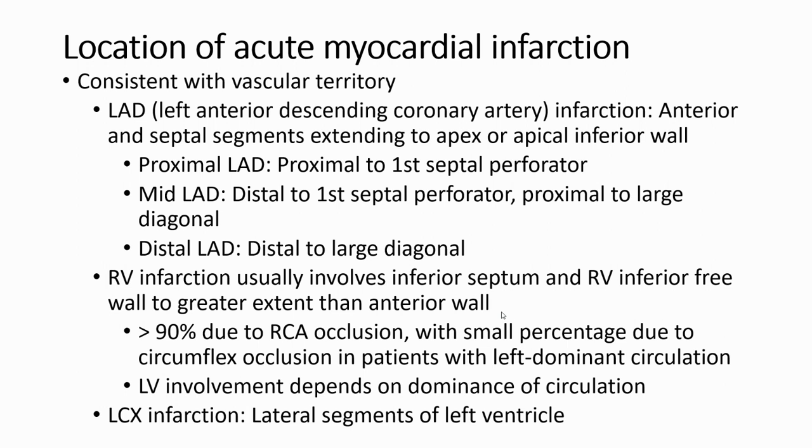Left ventricular involvement depends on dominance of circulation. Circumflex infarction involves the lateral segment of the left ventricle.